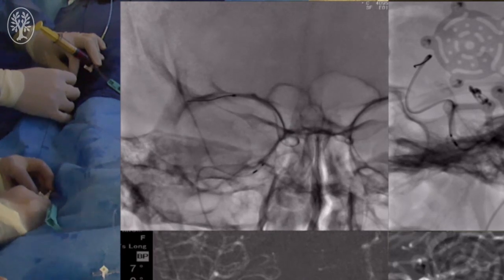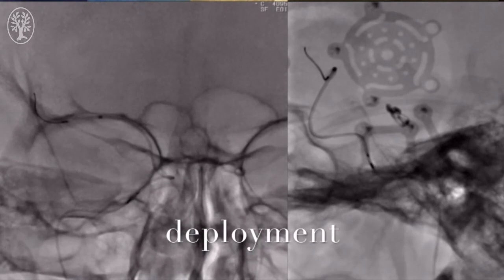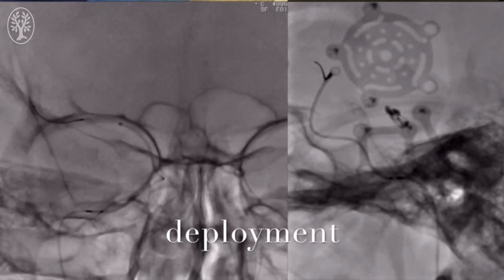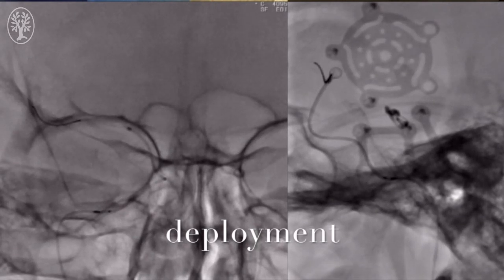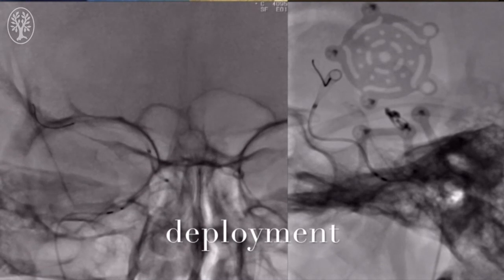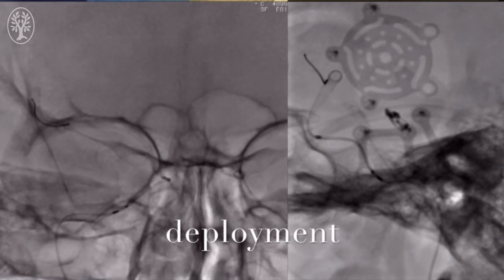The device is now delivered into the middle cerebral artery, and the whole system is now gradually being withdrawn backwards till we are ideally in the distal ICA, not jailing the ACA. The device is now being pushed. As the device is pushed, the microcatheter herniates backwards.